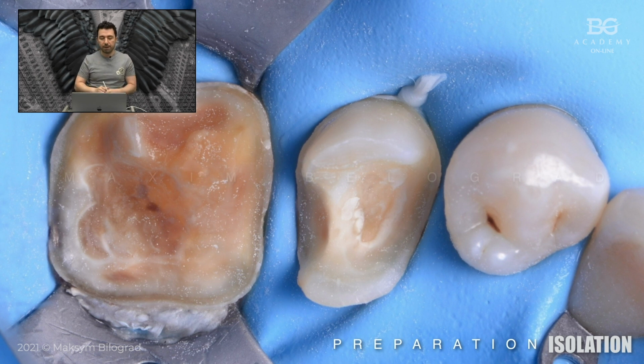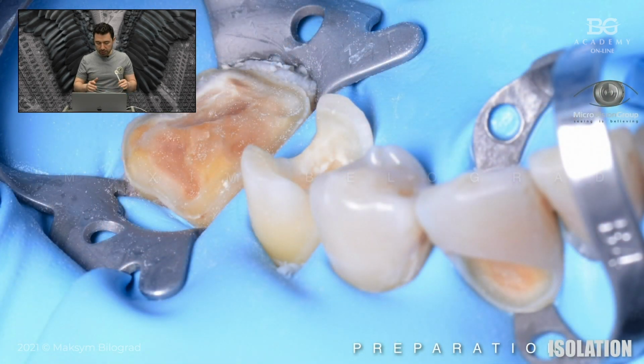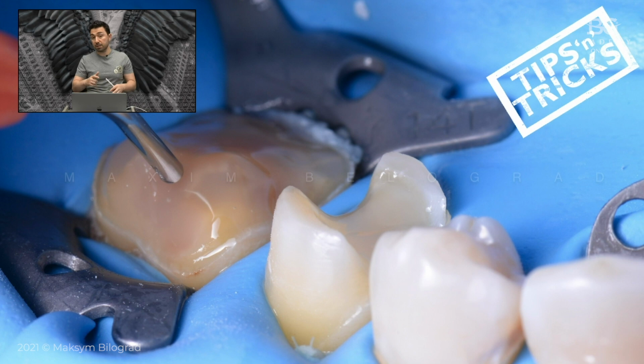So now we have modified rubber dam isolation. Then I provided sandblasting here with aluminum oxide to clean everything perfectly. Then here you can see a lateral view of the situation, and then we provided immediate dentin sealing with bonding agent and with a highly filled flowable composite.